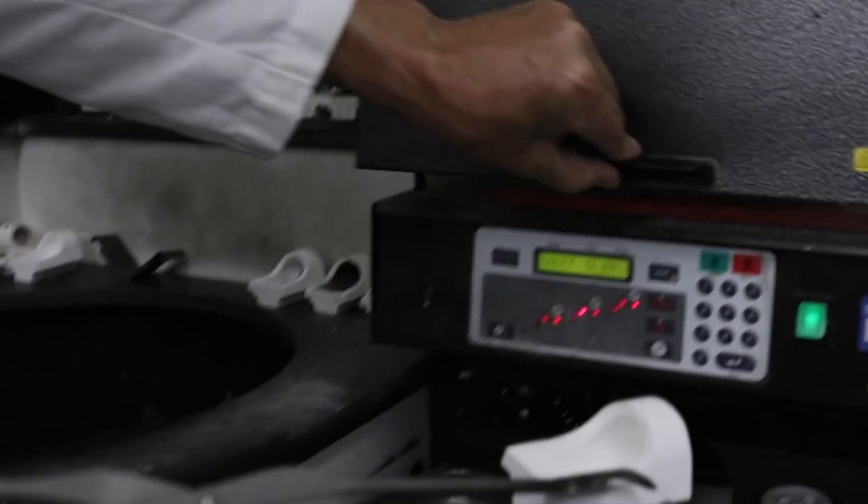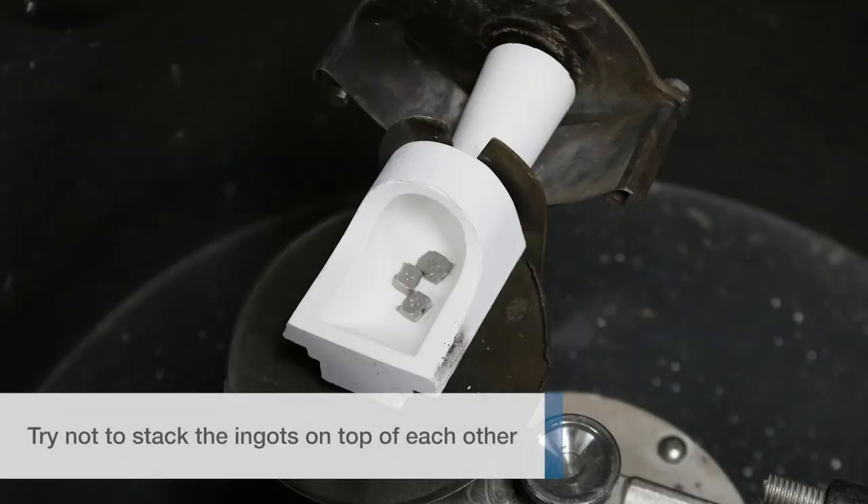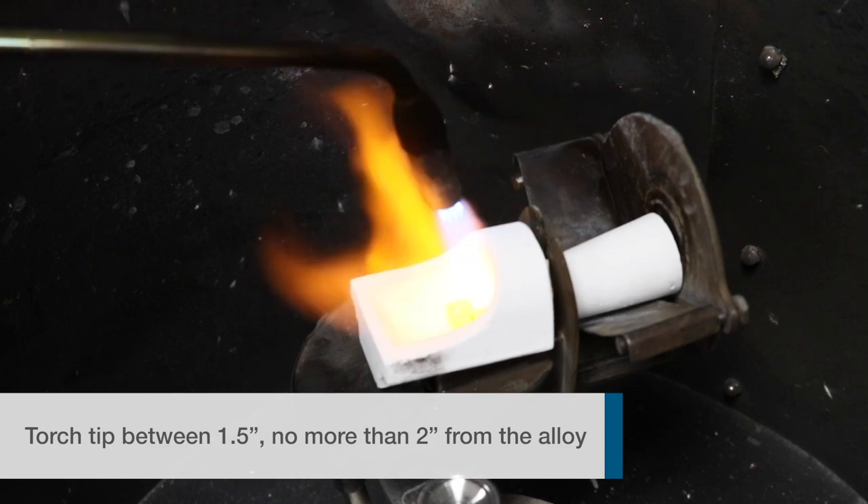Remove the crucible from the oven, place on the arm, then place the metal in the crucible. Try not to stack the ingots on top of each other if possible, then put the ring in the cradle. Your torch tip should be at least one and a half inches, no more than two inches away from the alloy when melting.